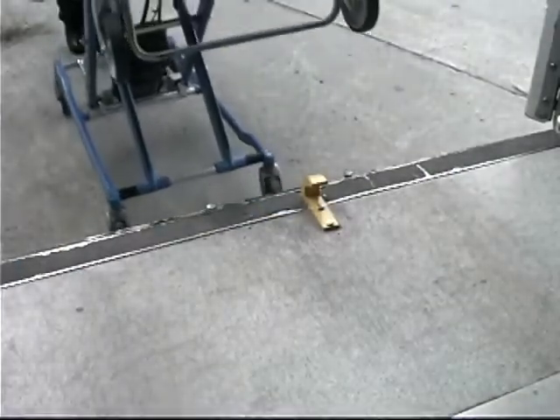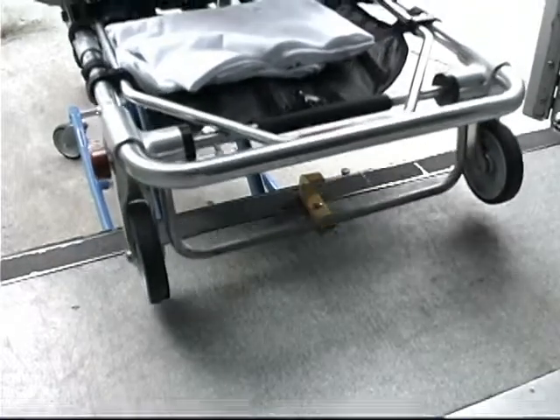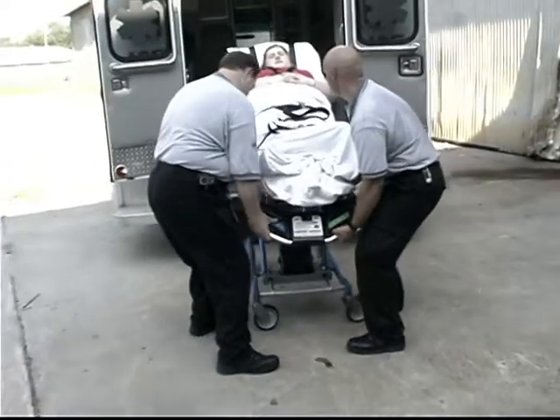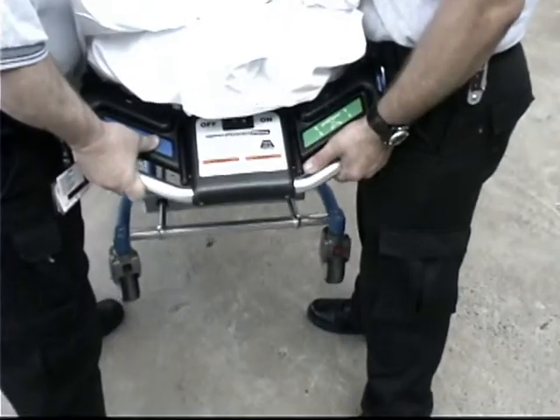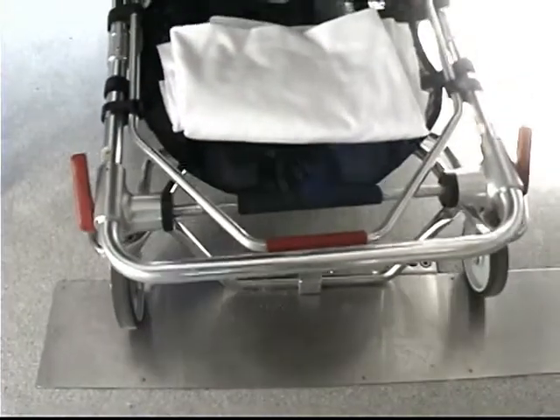Roll the cot into the ambulance until both loading wheels are on the patient compartment floor and the safety bar passes the safety hook. Both operators can then work together to elevate and hold the foot end of the cot level with the ambulance floor. The control operator presses and holds the blue lower load touchpad to fold the cot. Push the cot completely into the ambulance and secure the cot in the cot fastener.